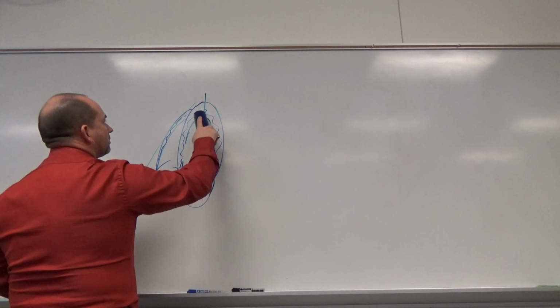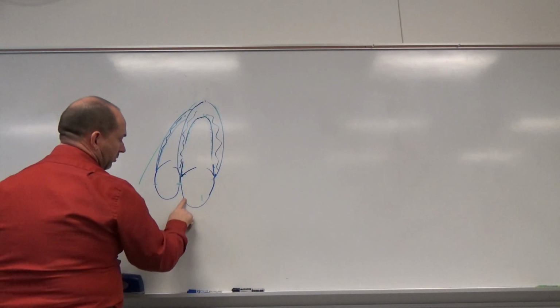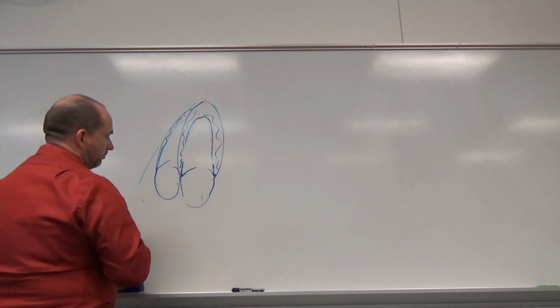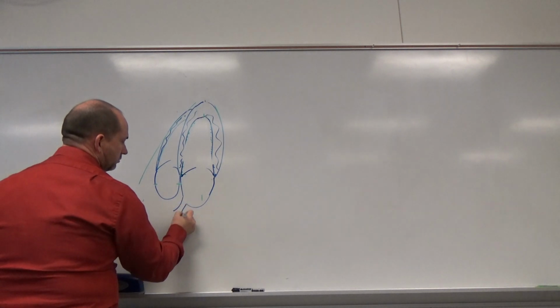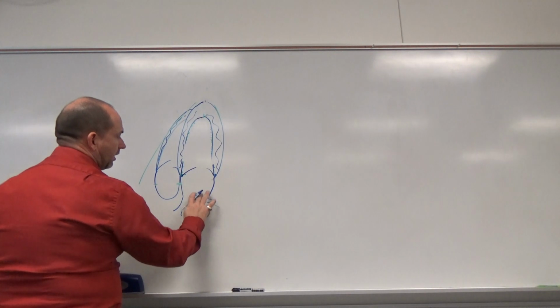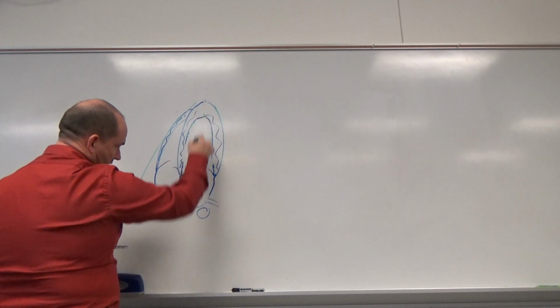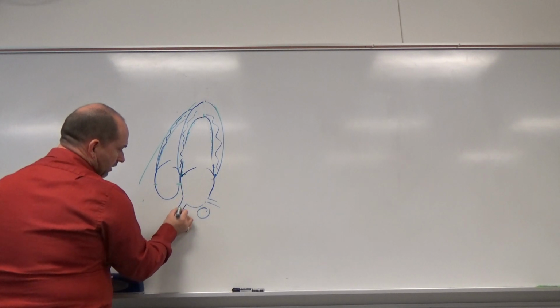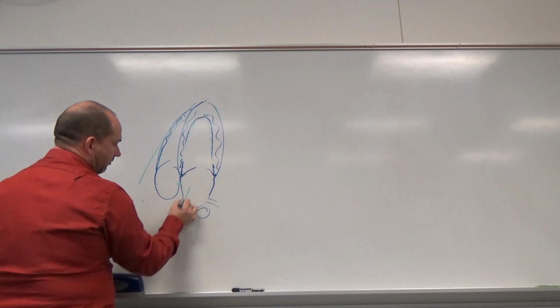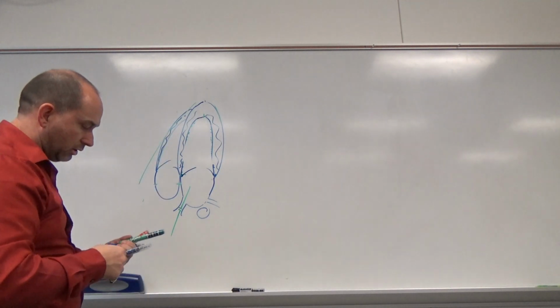Okay, then since we're in Doppler, we're going to do a couple different things. We're going to do a tissue Doppler, and we're going to do a spectral Doppler of the pulmonary veins. The right upper pulmonary vein, as we know, comes down here. Okay, you got your descending thoracic aorta there. Left upper goes that side. Now we're going to take our pulse sample and place the pulse sample in the pulmonary vein there. It's going to go up there, and you're going to line that up.